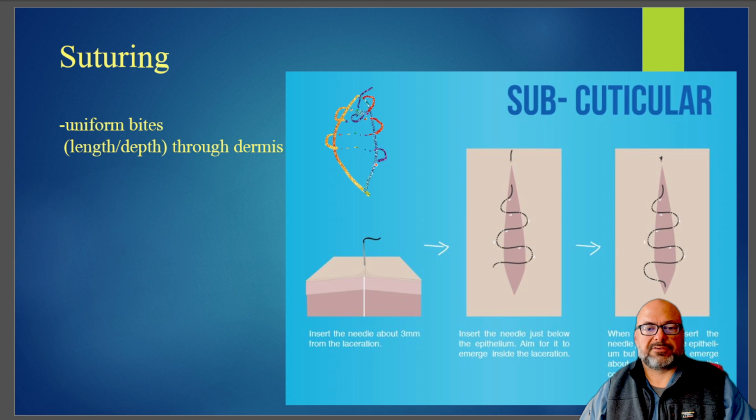So straight across here, and then straight across here, and then a loop through the subcuticular space through here, and then we would tie the single strand to this loop across there. So that's what they're representing here, that side-to-side motion. And there are a lot of ways to tie a knot at the end.